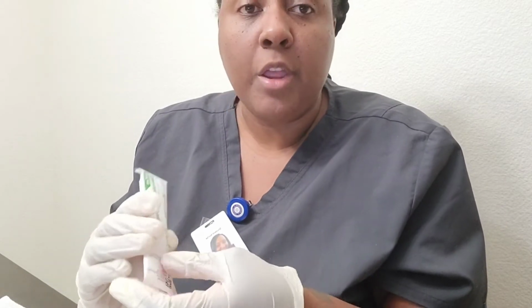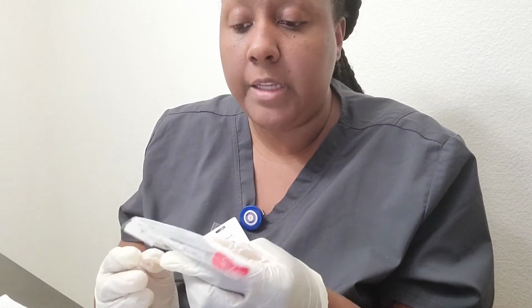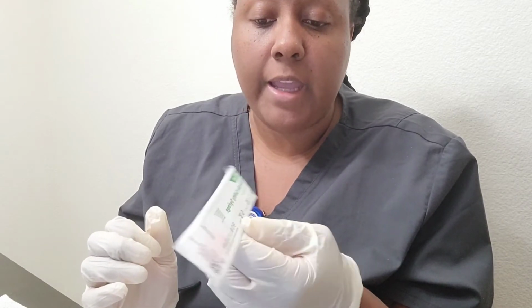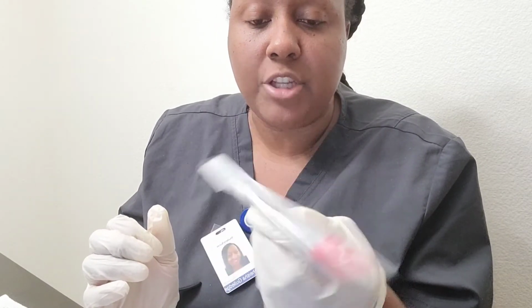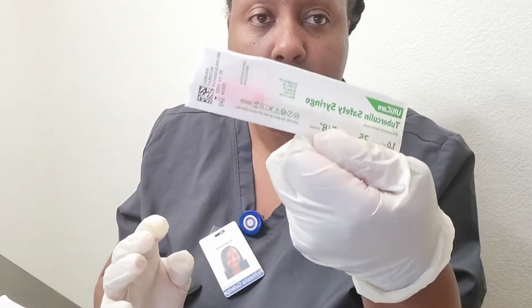Okay, so I will then go ahead and get the correct needle, the correct gauge, and the length of the needle and the size of the syringe. So I am using the tuberculin safety syringe, 1 ml, 25 gauge, and 5/8 inches. I'll go ahead and do that, and then I will draw.